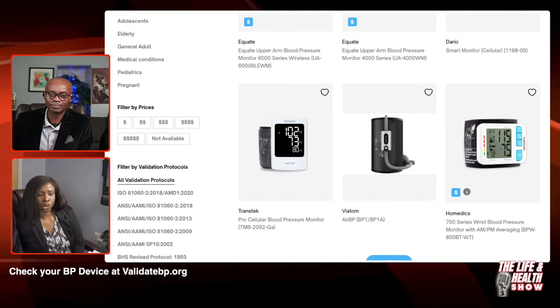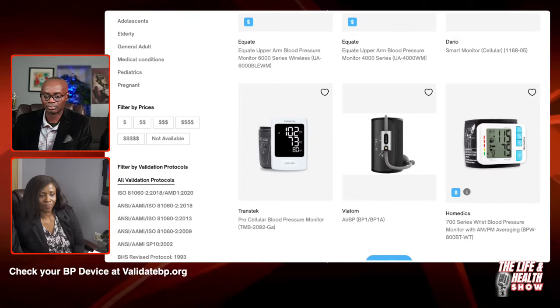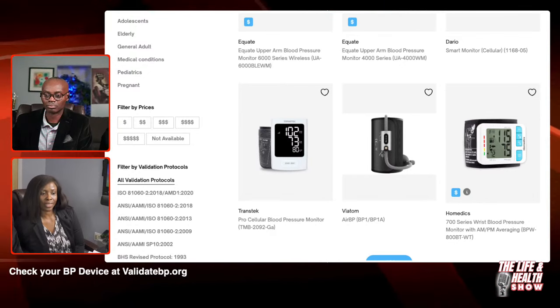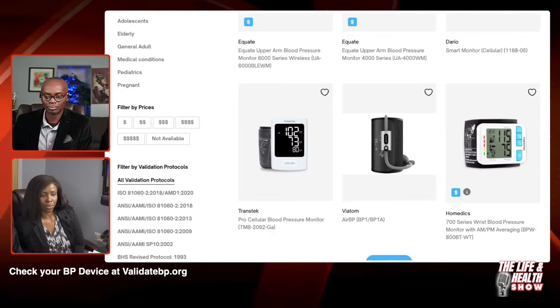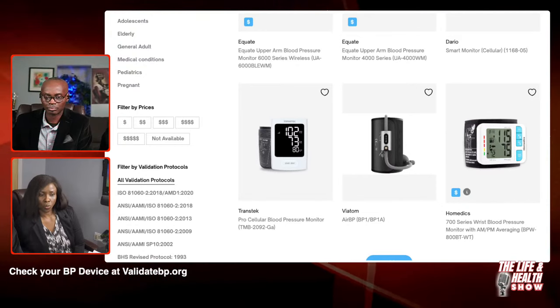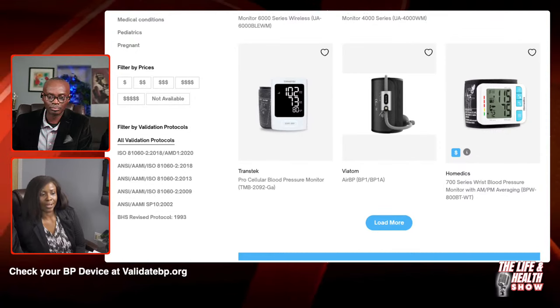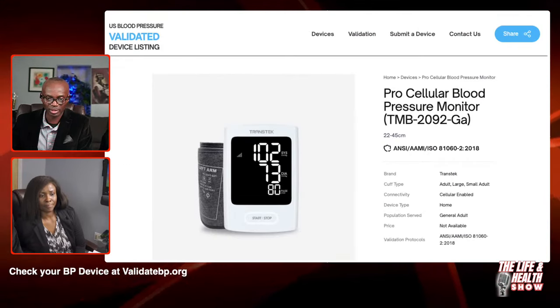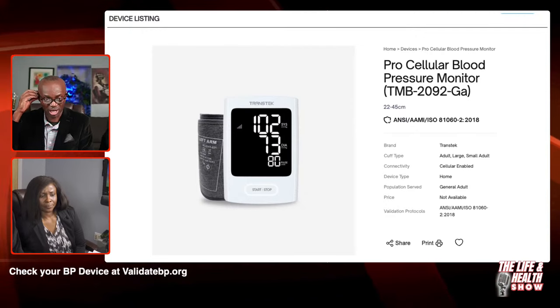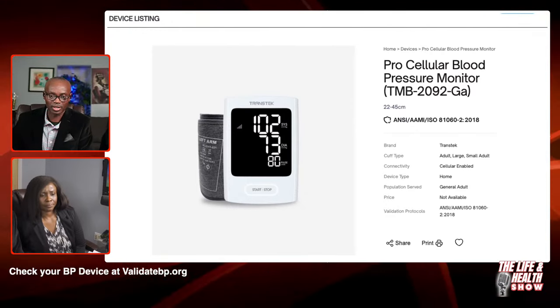Yeah, and if you are not sure, before you buy, you can always ask. If you go to a pharmacy, you can ask the pharmacist what they recommend. I'm sure they know the ones that are popular and the ones that have been validated already. So you can always ask to see whether whatever you are about to buy is the appropriate one. Definitely. Whatever you are about to buy, you can check with a pharmacist or your doctor and make sure that you get the right ones.